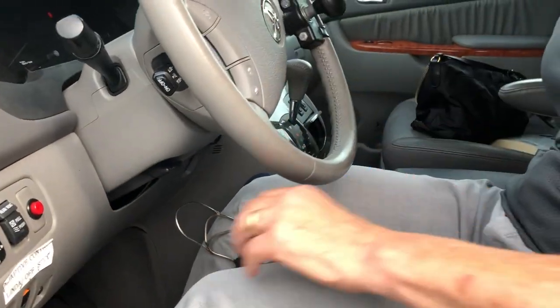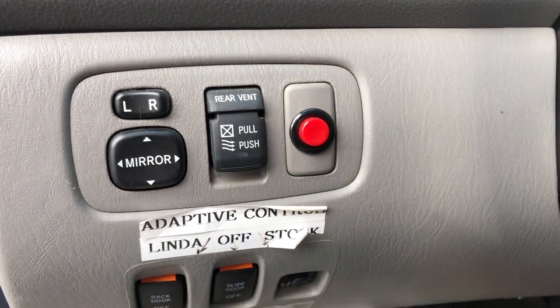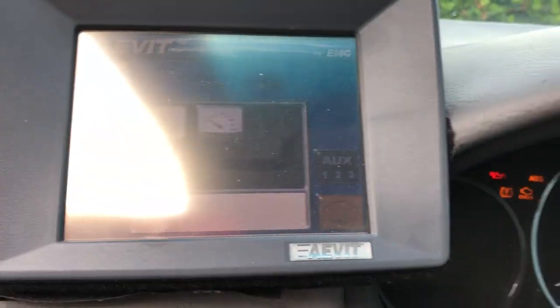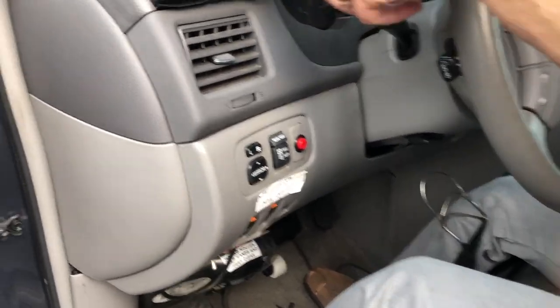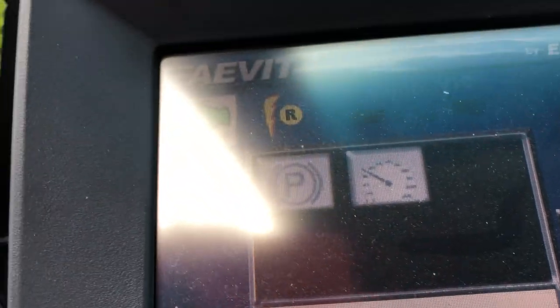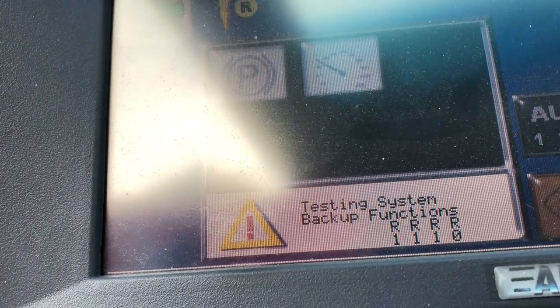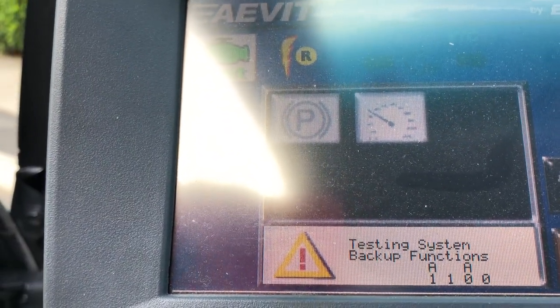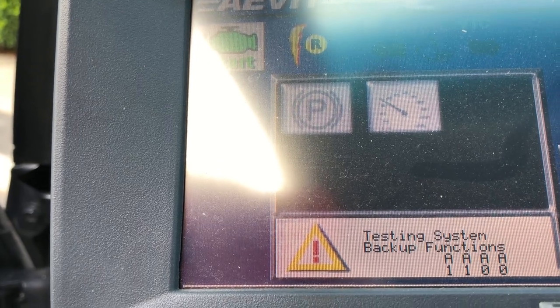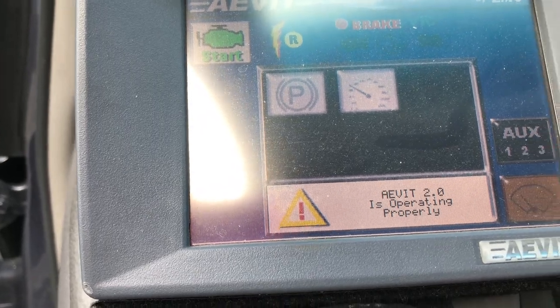Put the key in and I turn the computer on, which is right here. And then up here is where the computer comes on — there's a screen up there. It runs through a computer check, and when it gets to the end it'll tell me that I have to boot it and give it gas or brake twice. Then it'll be ready to go — it takes about a minute. And now it's ready to go.